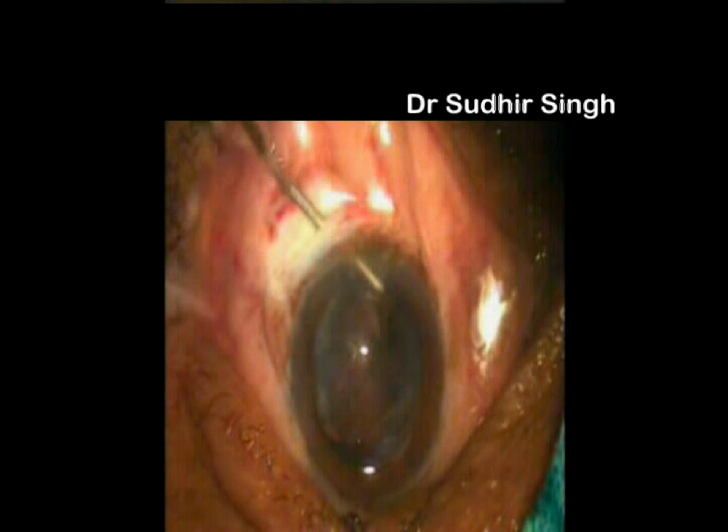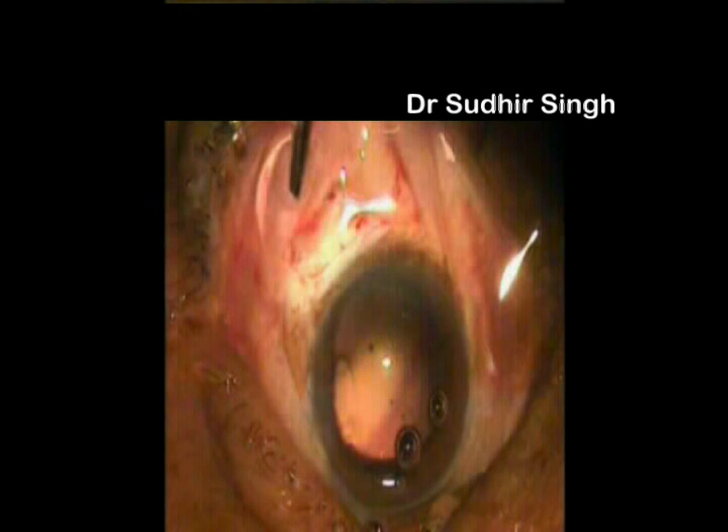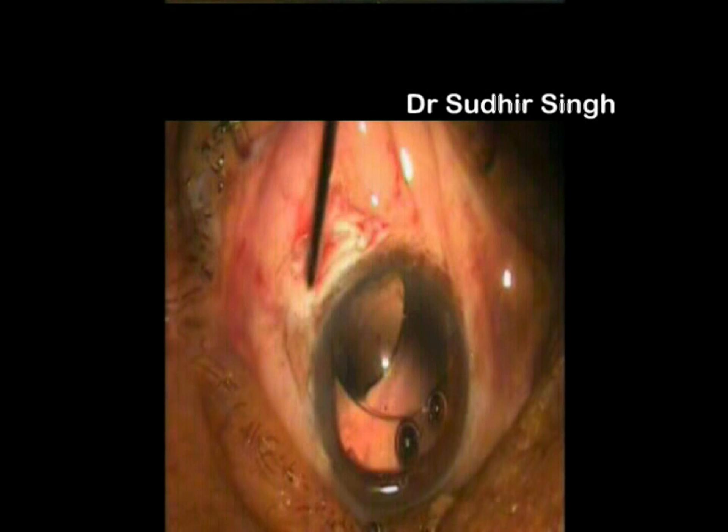The remaining cortical matter is cleaned up. A single-piece PMMA intraocular lens is implanted into the capsular bag.